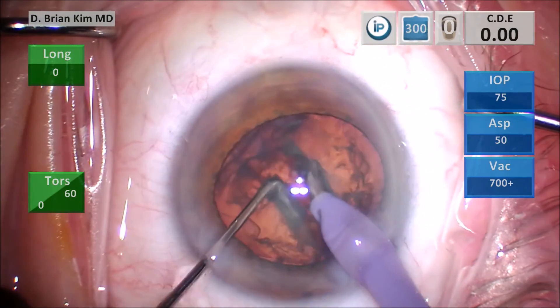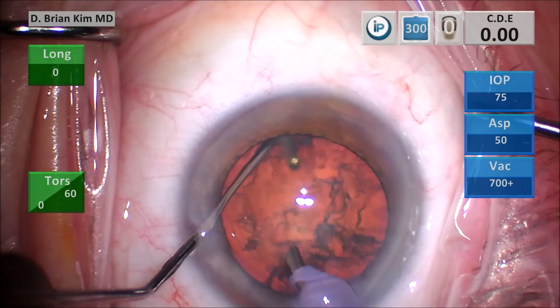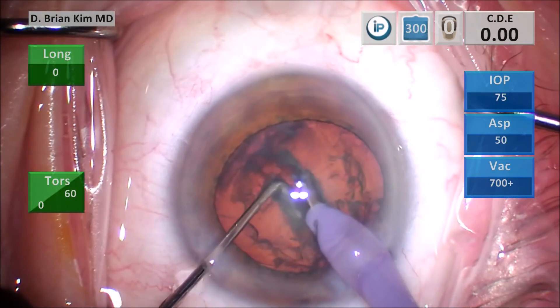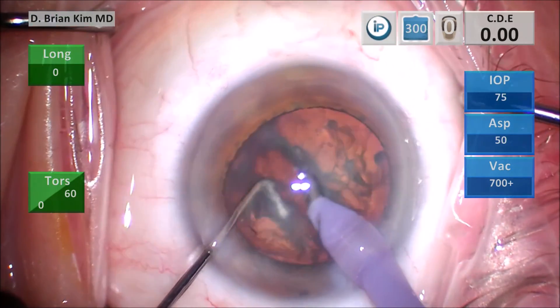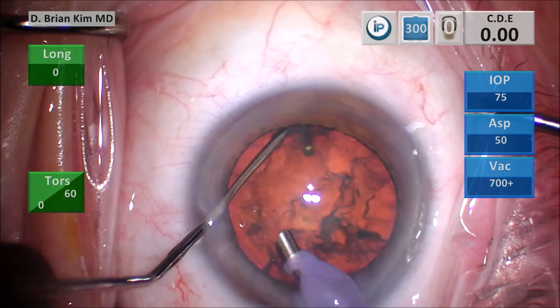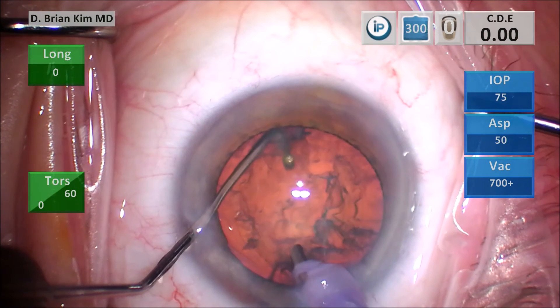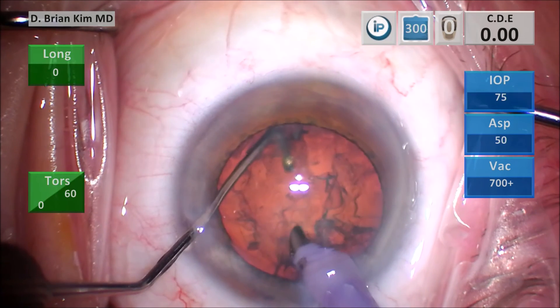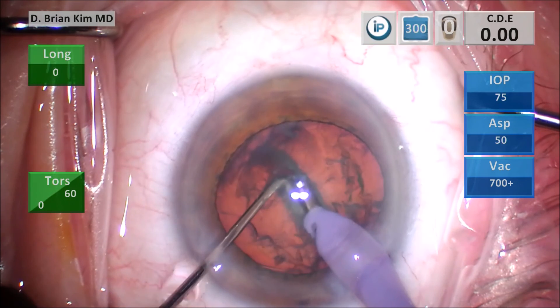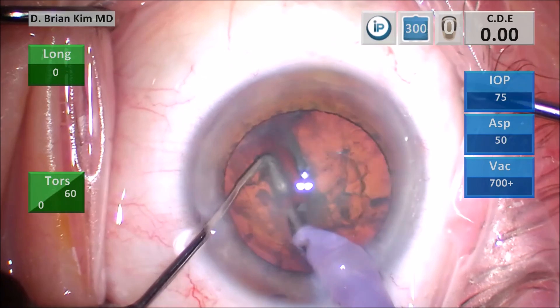Now you want to tilt the facotip more vertical and then fracture the lens. In half speed, look at the facotip — tilt and then meet in the middle and chop. In super slow motion, focus only on the facotip: you can see the facotip tilting vertical. With the lens being held from below with the chopper, you drive the facotip into the lens and the lens is fractured. I hope this detailed explanation will help you perform the technique.